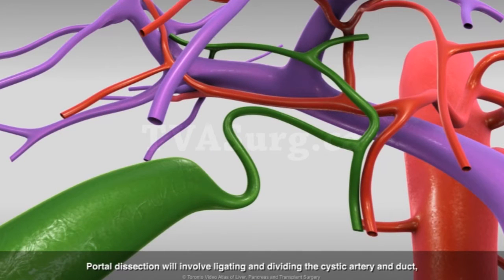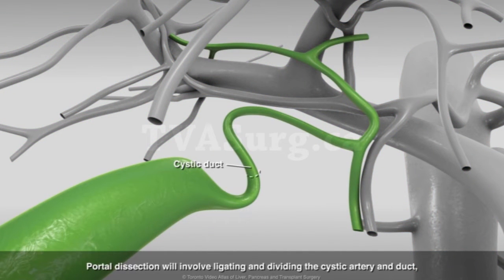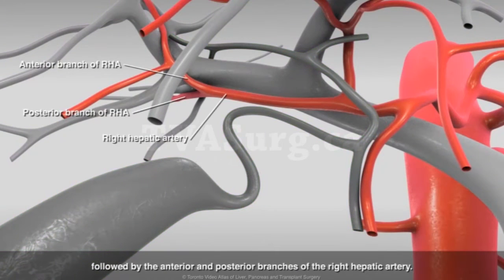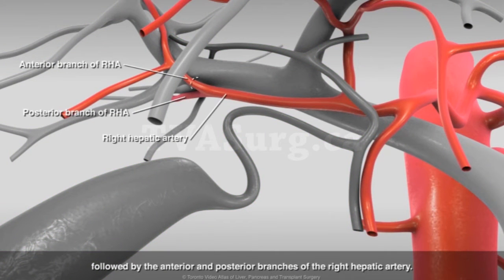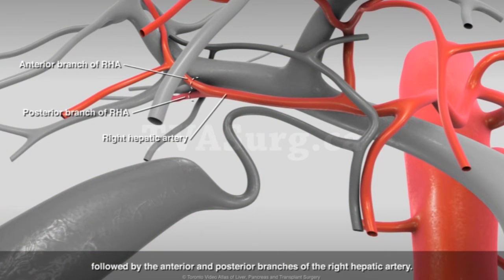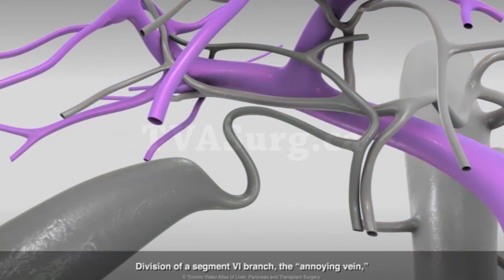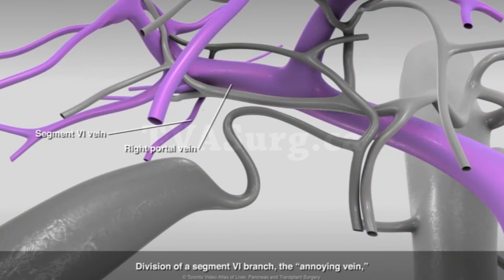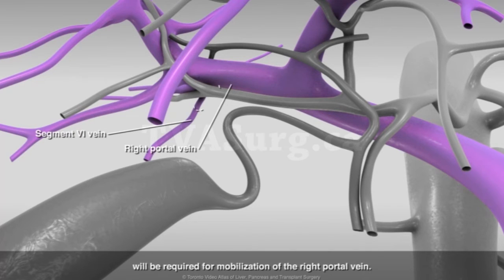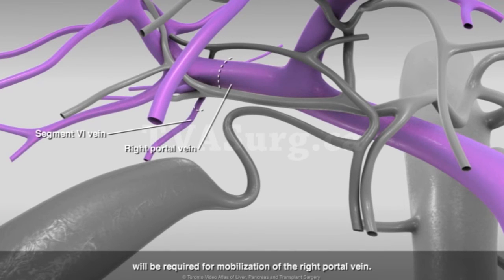Portal dissection will involve ligating and dividing the cystic artery and duct, followed by the anterior and posterior branches of the right hepatic artery. Division of a segment 6 branch, the annoying vein, will be required for mobilization of the right portal vein.